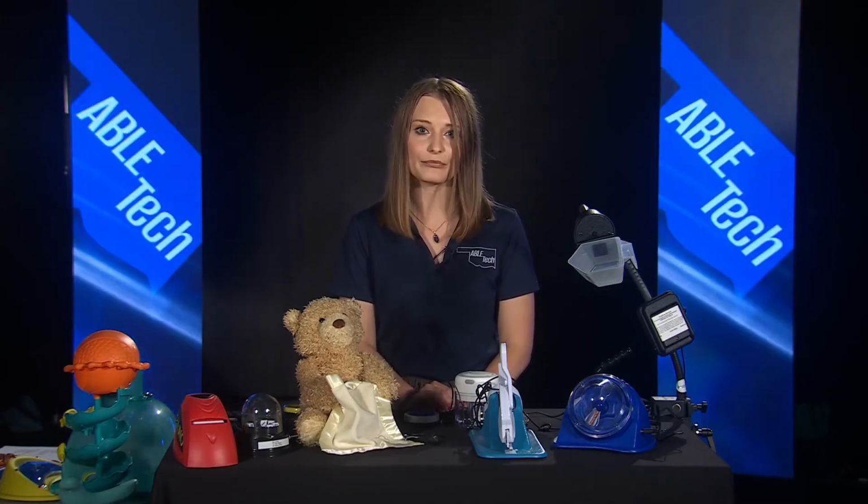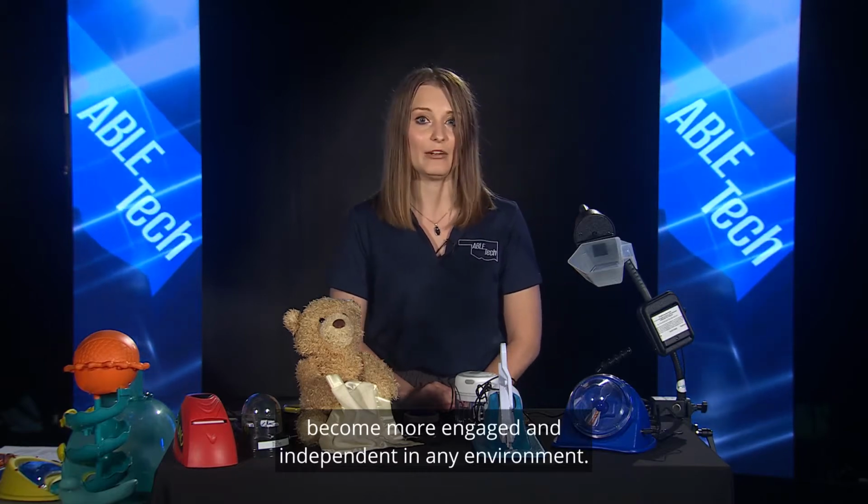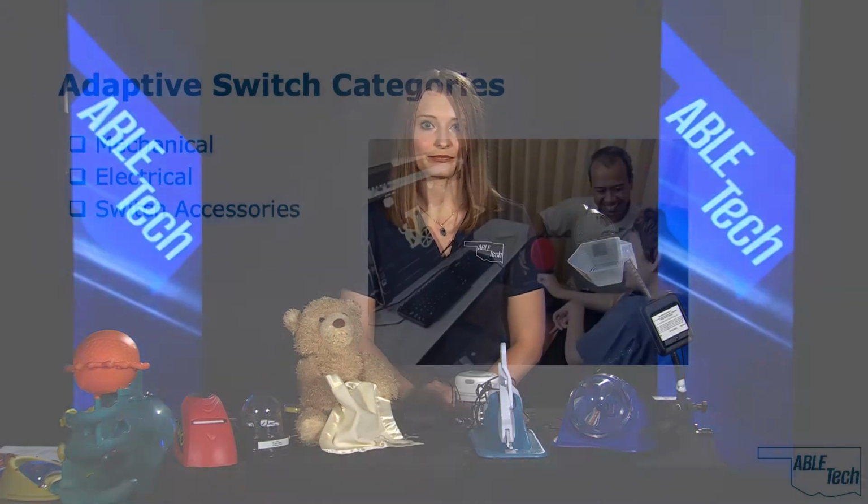Switch access changes lives. The goal of this video is to increase your knowledge of adaptive switches so you can help individuals with motor limitations become more engaged and independent in any environment. You'll also learn where to go for help to find switch adaptive solutions.